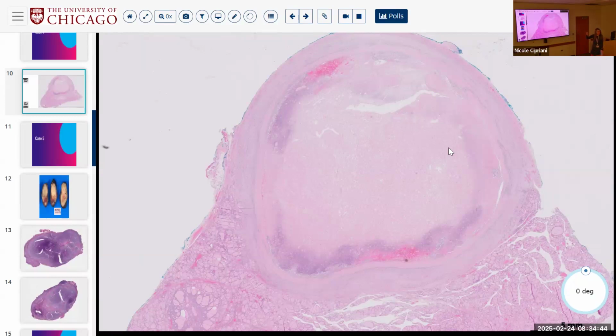But specifically, this happens with oncocytic things. You can get partial infarction, so like half of it is dead, and usually, again, the viable tissue is going to be at the periphery. So submit the periphery and see if you can see any viable tissue, okay?